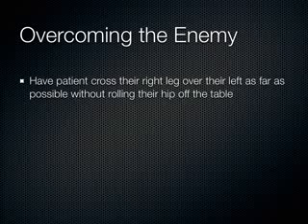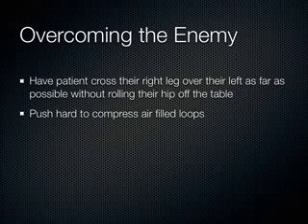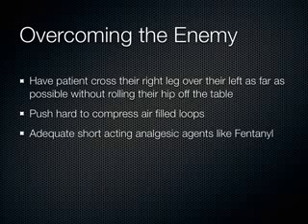So how do we overcome the enemy of bowel gas? Well, the first thing I do is I have the patient cross their right leg over their left leg, and we'll do this today with the models. On my earlier demonstration, I forgot to do that, but I think it's important to put the right leg over the left leg as far as possible without the patient falling off the table. And then you're going to push really hard. You're going to push harder in the abdomen than you've ever pushed before with an ultrasound transducer today. But don't worry, the models are getting paid to tolerate that. They'll push you away if it hurts too much.